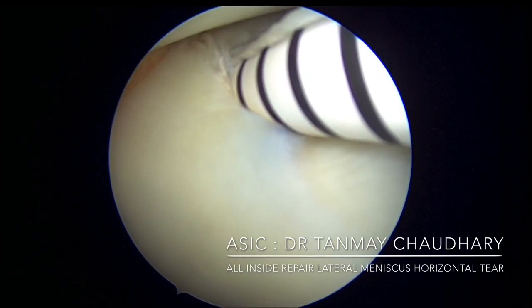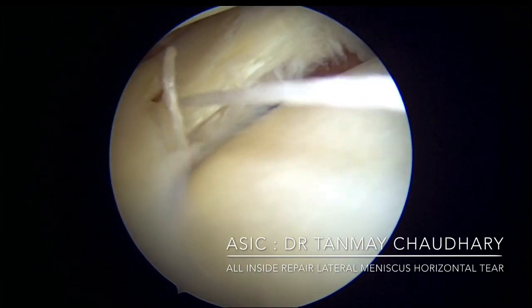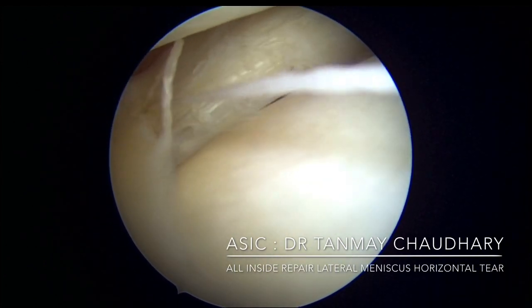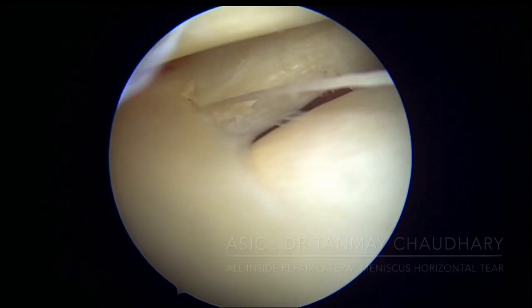Take out with a swiggling movement, then pull on the thread to tie up the knot. Secure the knot with a probe.